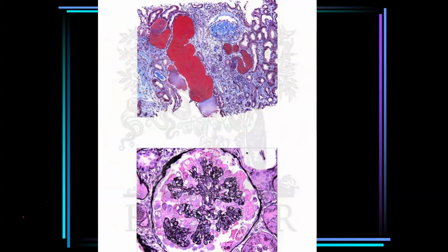As we discussed the last time, when we look inside the renal tubule lumen, you may find another colloid-like cast or colloid-like debris inside the lumen. This is something different from the thyroidization form of tubular atrophy we just discussed. But this condition you may meet in patients who have HIV.